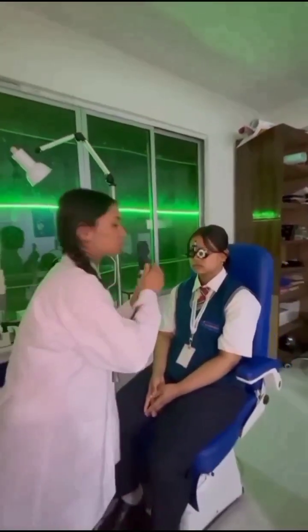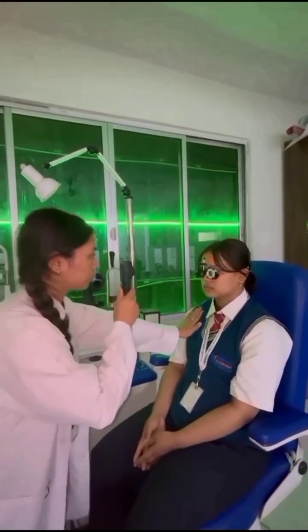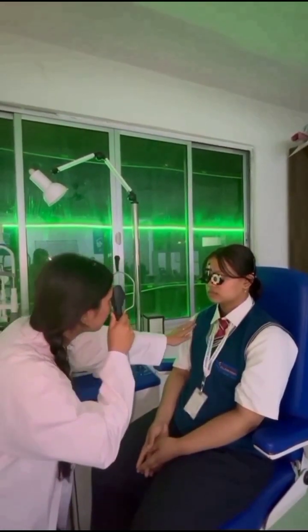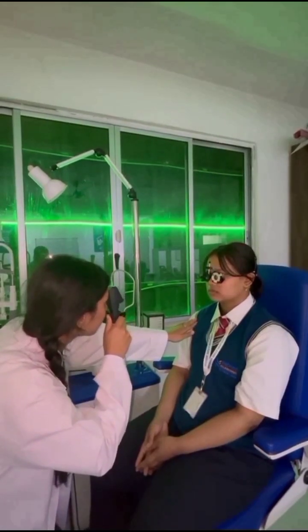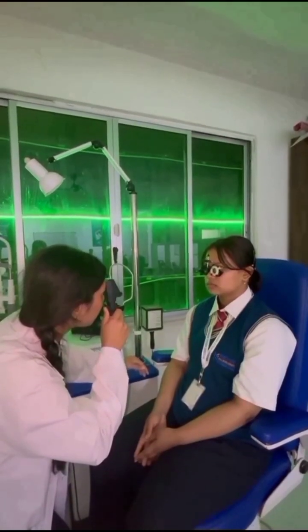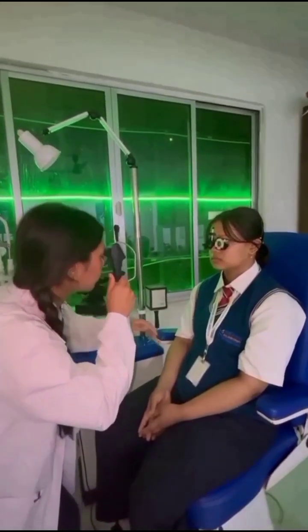So, if the reflex moves with the streak, it suggests hypermetropia or low myopia. If it moves against the streak, it indicates myopia greater than minus 1.00 diopter. If there is no movement, the reflex is neutralized.